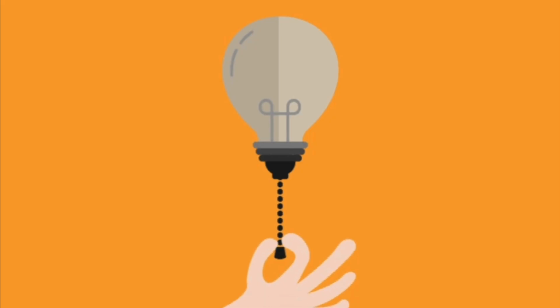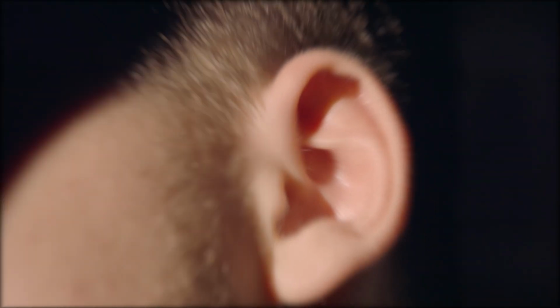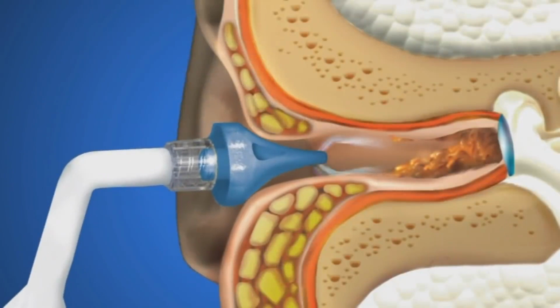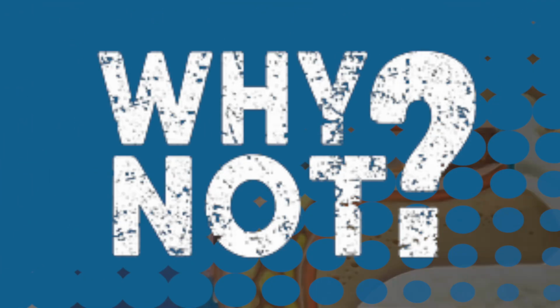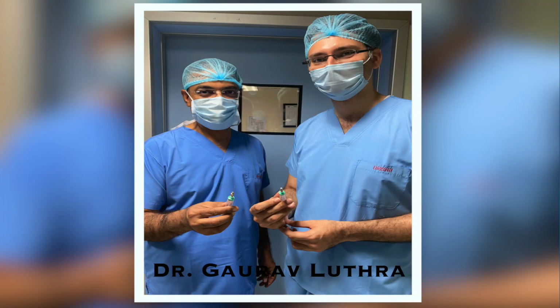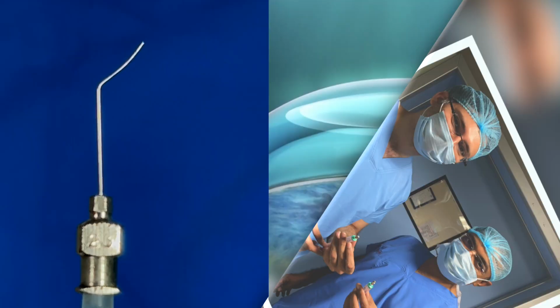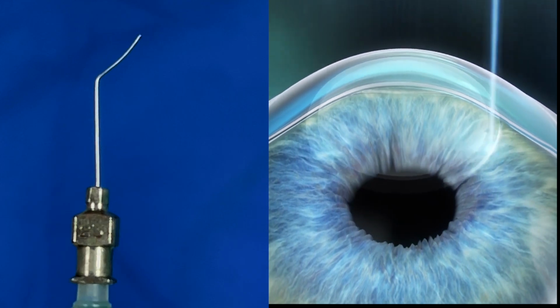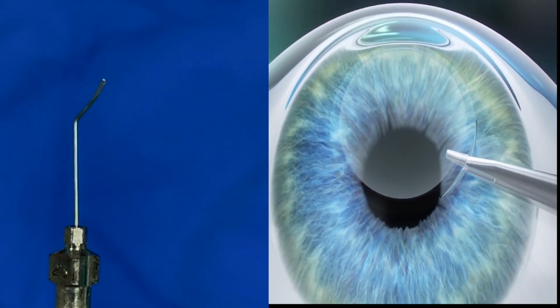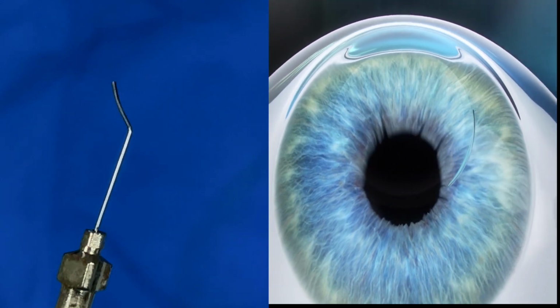So where did the idea originate? One day, I had a severe earache and I went to my ENT friend for a checkup. He told me that wax is the culprit for the earache and removed it by irrigating my ear cavity and not pulling it out, which got me thinking. If the ENT can do it, then why not use it in ophthalmology? So I took this idea to my mentor, Dr. Gaurav Luthra, and we developed a hydrocannula to extract the lenticule, making SMILE surgery further less invasive and extracting the complete lenticule without any cuts and tears.